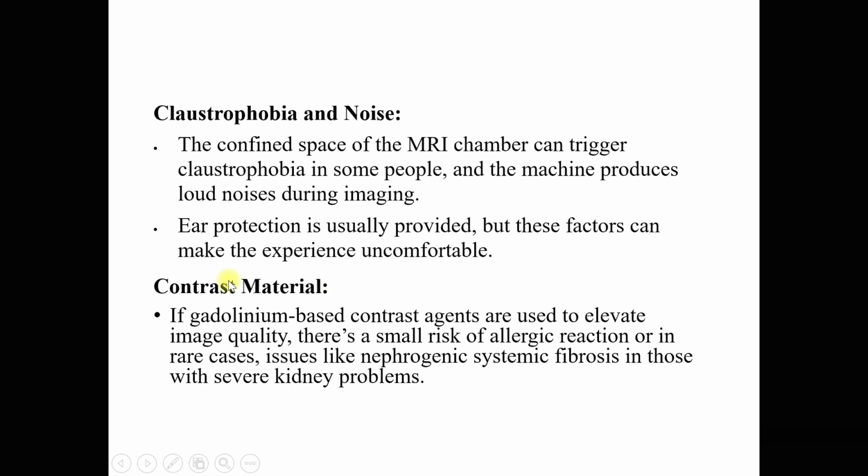The other side effect is contrast material. If gadolinium-based contrast agents are used to elevate image quality, there is a small risk of allergic reaction or, in rare cases, issues like nephrogenic systemic fibrosis in those with severe kidney problems. If you are going to use contrast agents like gadolinium-based contrast agents, we have to be cautious in patients with kidney impairments.